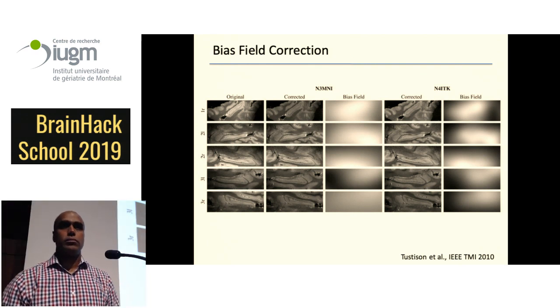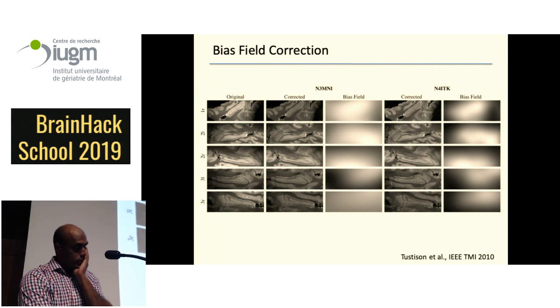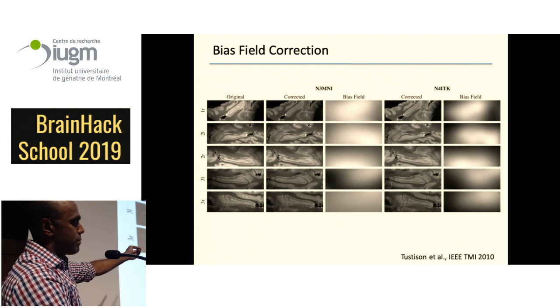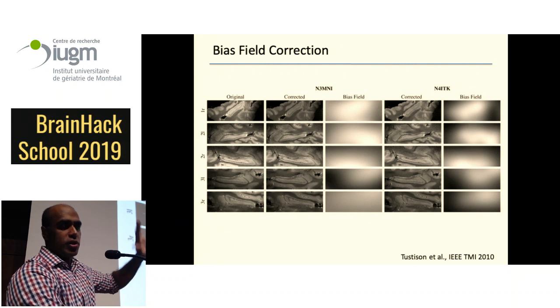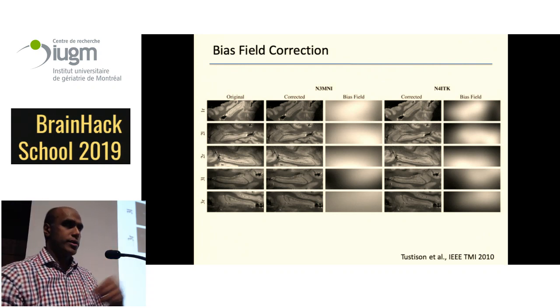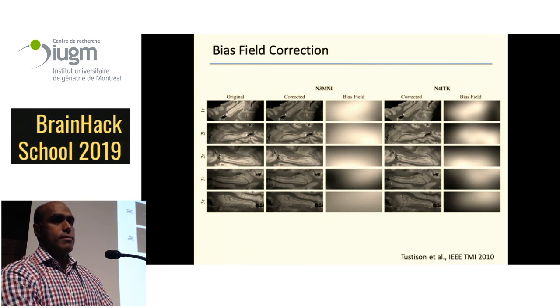Yeah. Thanks. I was wondering, is that a kind of issue related to the strength of the field? Like with the 7 Tesla, maybe that will be less of an issue? So these are actually, I think, 9.4 T images from this paper in particular. The higher field strength you go, the more issues you have with inhomogeneity in general. Certainly at 3 Tesla, when you start using faster switching gradients and more intricate head coil configurations, the bias field tends to be more focal in different regions depending on the transmit-receive characteristics of the head coil.